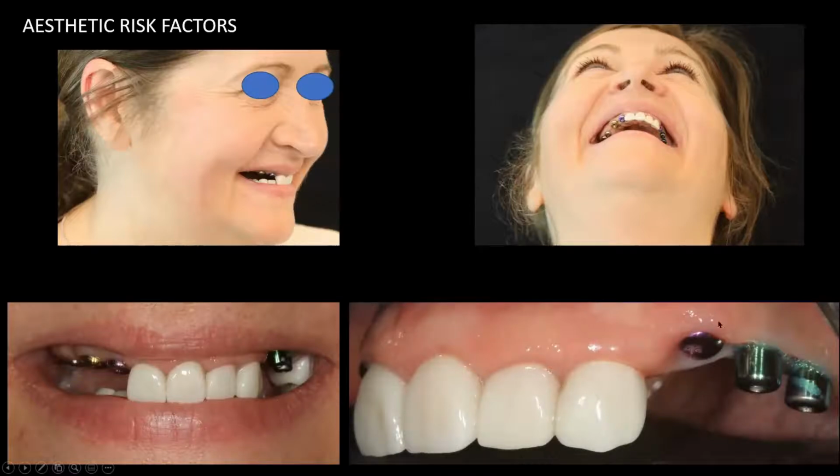Why is there a big vertical defect? Because he took this tooth out, he says, I'll put 3 implants in to be better. Now, before this tooth was taken out, that line of bone was about here, and it should be comfortable. So the premolar was removed because it was a better outcome.